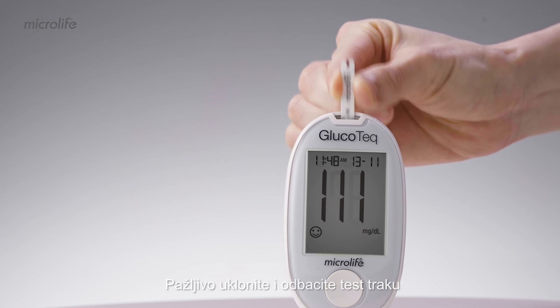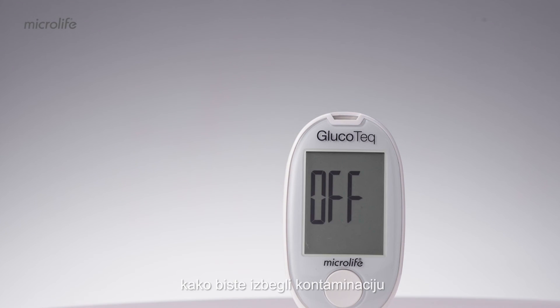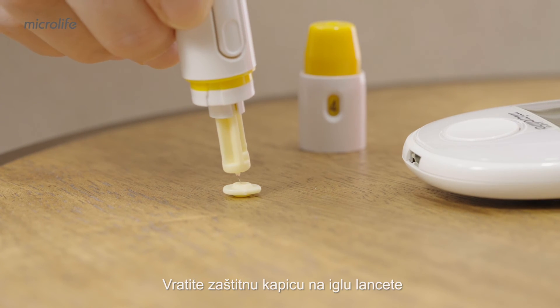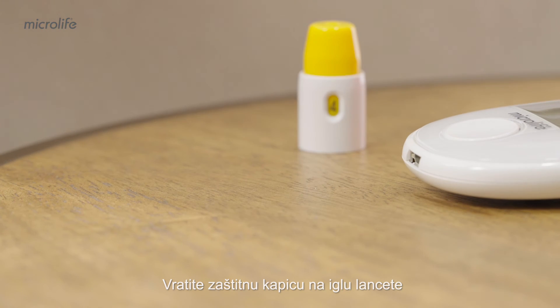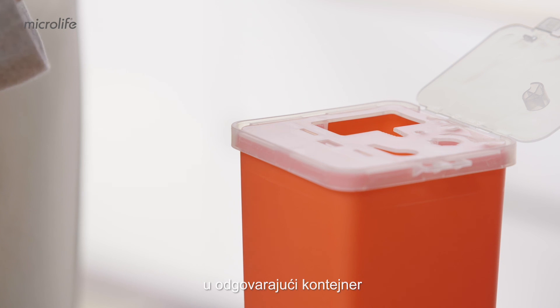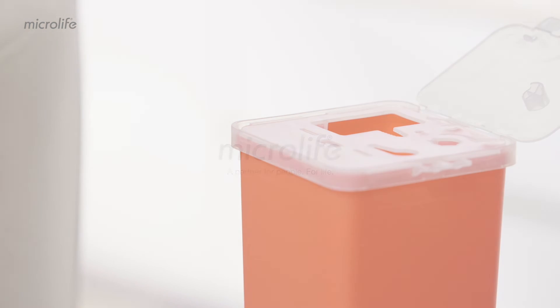Remove and discard the test strip carefully to avoid any contamination. The meter will automatically switch off by removing the test strip. Put the cap back onto the needle of the lancet. Make sure that the lancet is discarded in the appropriate container.